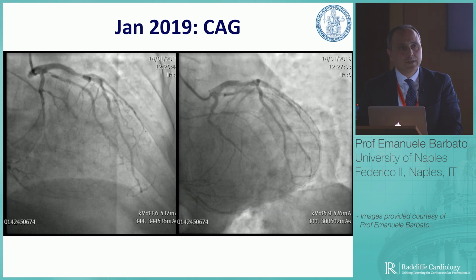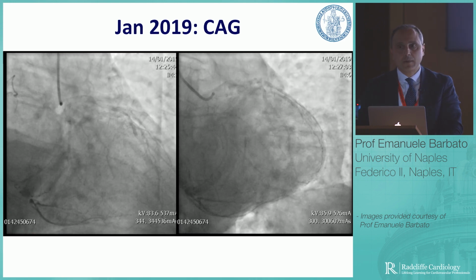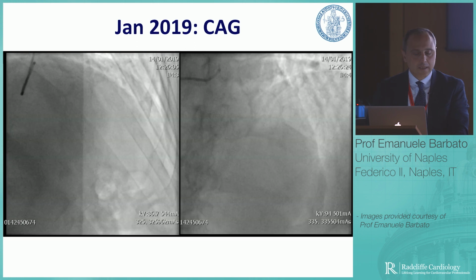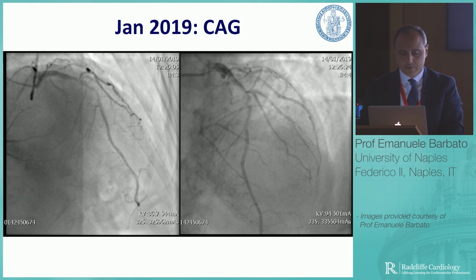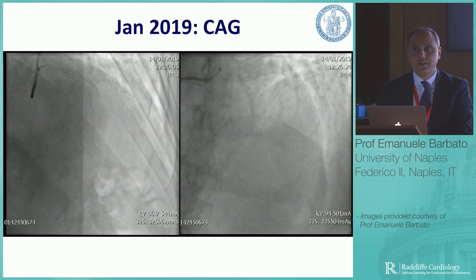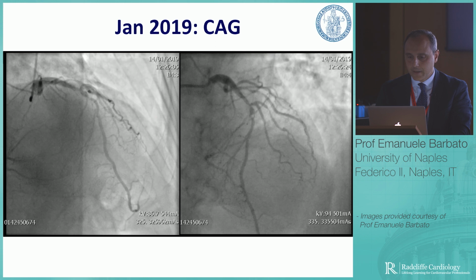And this is the left coronary angiogram. So you see this patient has also a problem in the medial LAD, and there is quite a good amount of collaterals to the right. I give you also this other projection, where you can perhaps better appreciate the stenosis in the medial LAD. You can already start seeing the problem there, namely that there is a decent amount of calcium.